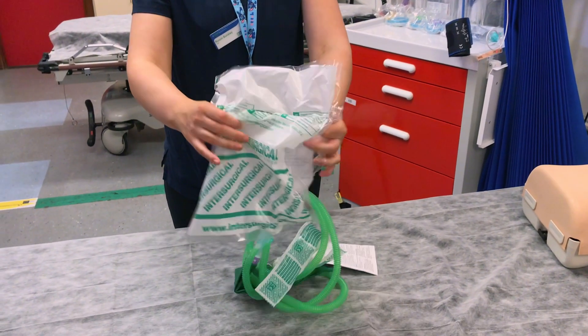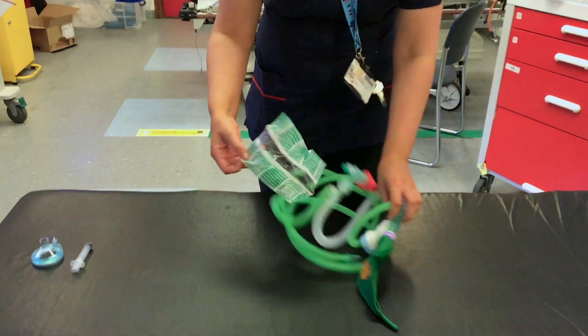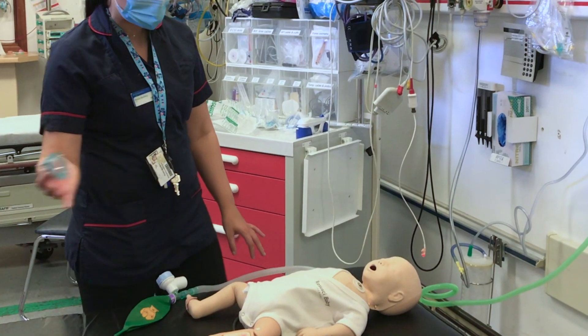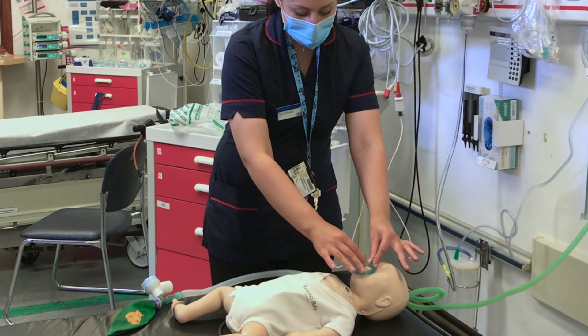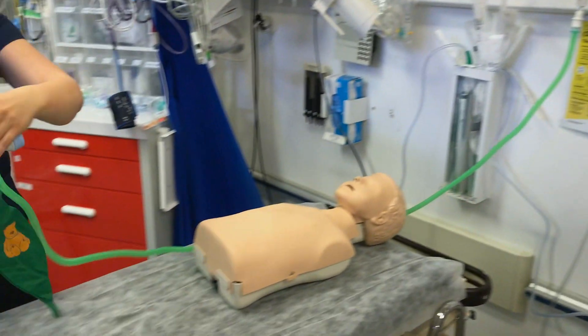Open the C-circuit bag — it's easiest if you open it onto a hard surface, otherwise the stuff just goes everywhere. Don't lose that little bag inside, as it contains a white rubber attachment that allows the C-circuit to be attached to the wall oxygen. Take the red bung off — this is where your mask is going to go. Size up your mask, making sure it covers the bridge of the nose but not the eyes, and goes below the lower lip but not overhanging the mandible. Inflate the cuff of the mask with some air to get a really good seal.